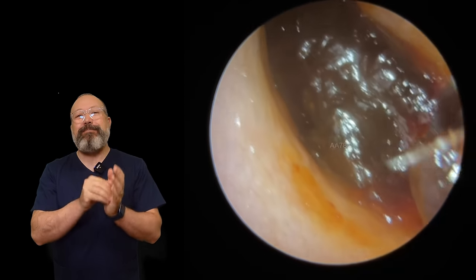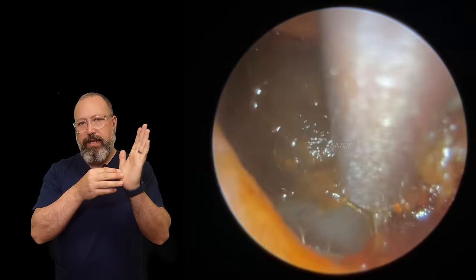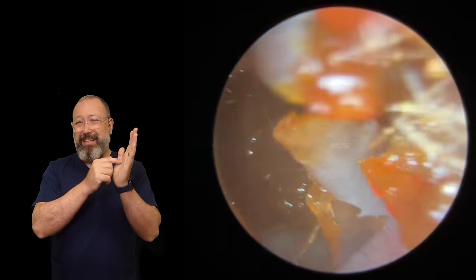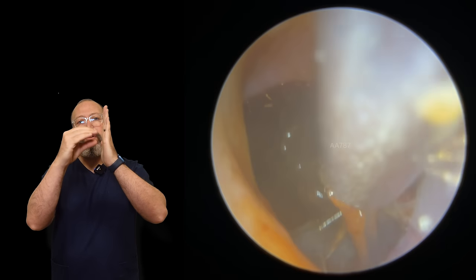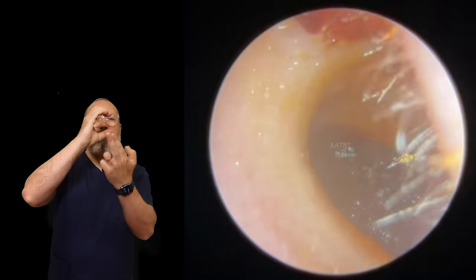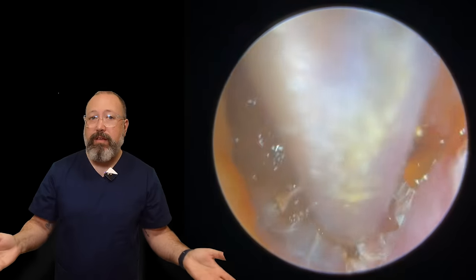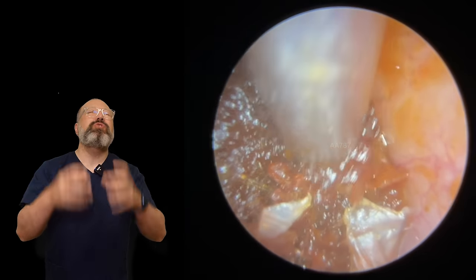With that really mushy wax or any thinner softer layer on the eardrum — when it's on the canal wall you can pass over it and draw the suction tube back to suck it in. But when it's stuck on the eardrum, you can't scrape across because you run the risk of perforation and it's very uncomfortable. What you have to do is hover just above the eardrum and take little scoopy bits off, working in lines up and down. You'll still end up with some remnants because it would be too uncomfortable to remove completely, and a suction tube against a very thin remnant won't suck it off — it would need scraping. The patient can wash those tiny bits off in the bath or shower.